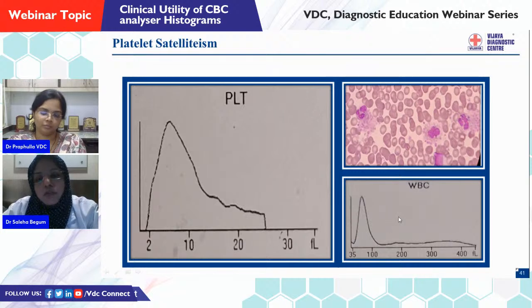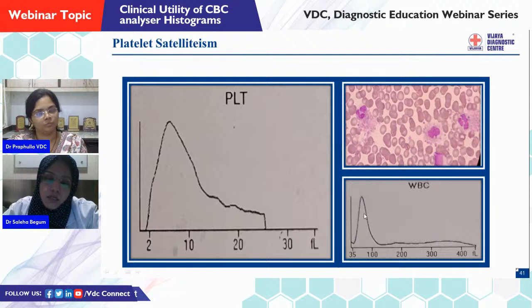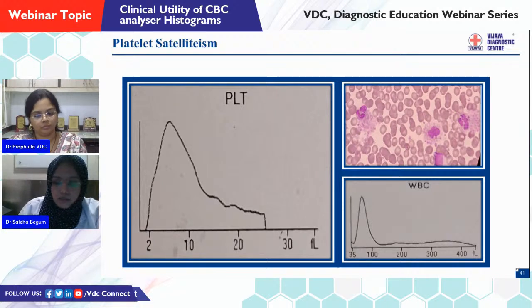And like the previous one, this WBC graph also is not starting at the baseline, but somewhere in the middle, giving us another clue that there is something present in the blood which is smaller than a small lymphocyte population. So we have to look for platelet aggregation or NRBCs. Here in this case it is platelet aggregation.